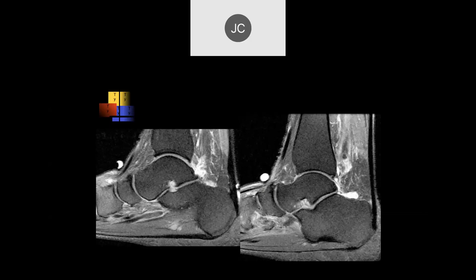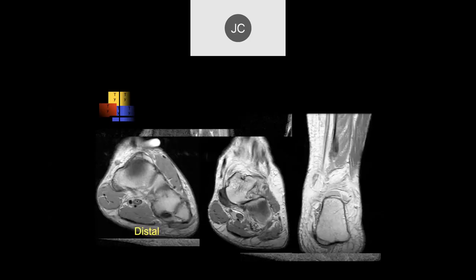Here we have a skin marker overlying the navicular, with degenerative change of the dorsal talonavicular joint. We see a small structure here that stops, and another small structure up here that also stops — this is a more proximal tear of the flexor hallucis longus. Looking distally, we can see a very tendinotic distal flexor hallucis longus. Here's the flexor digitorum in the crossover area, and here is the proximal component retracted proximally. This was a proximal flexor hallucis longus tendon tear.